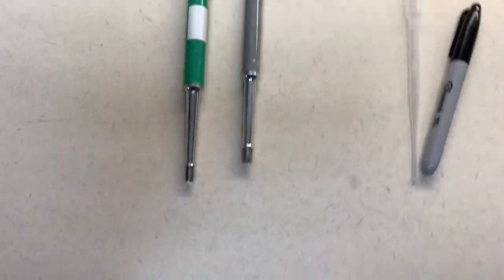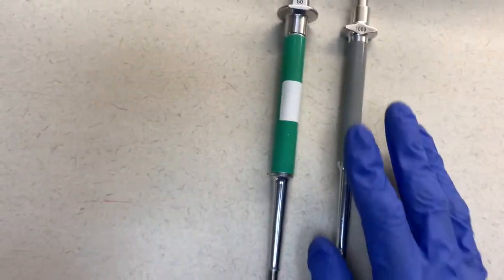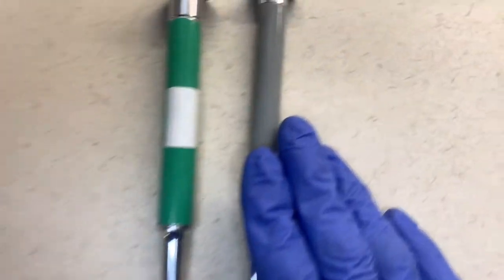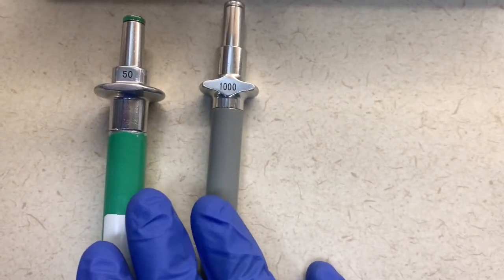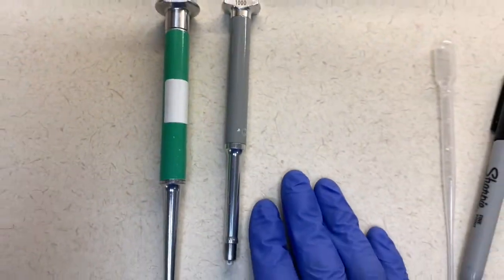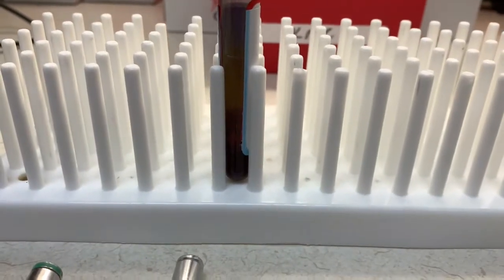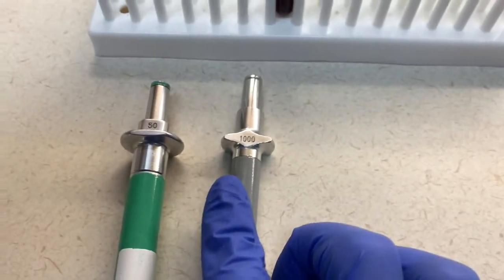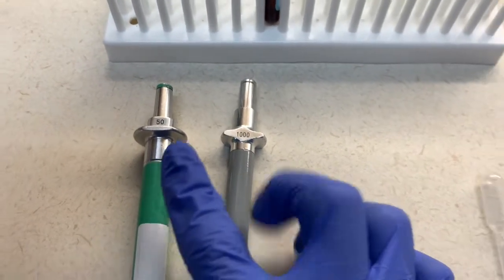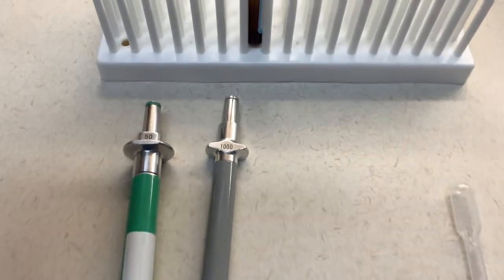And this step is a little more complicated than the others. So there's a couple ways to go about this. I've learned some tricks so far here. You can either use a couple of volumetric pipettes. You can see the volumes written here. You can use each one to remove as much sample as you can, taking note exactly how much you remove. If you remove one of these and 3 of these, you're going to need to be able to replace one of these and 3 of these in the saline.